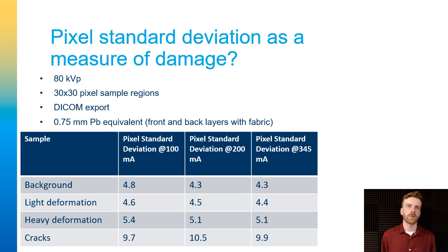As you might expect, there is a trend of increasing standard deviation with damage, but there isn't much benefit in cranking the tube to max mA.